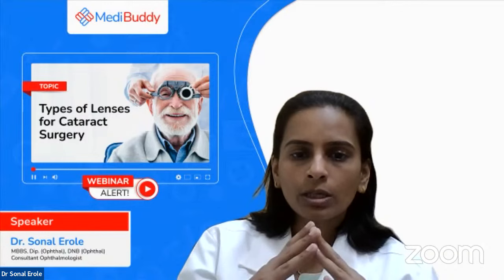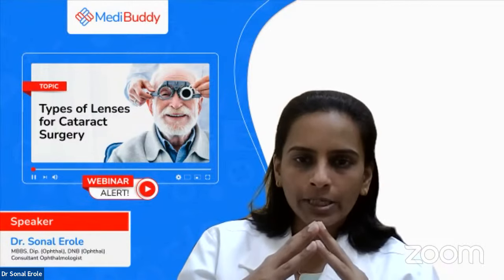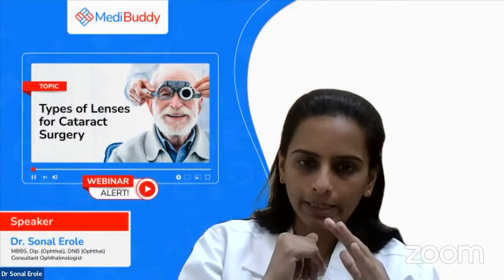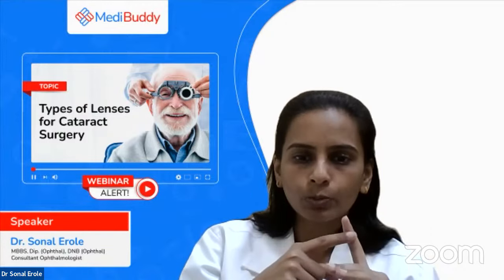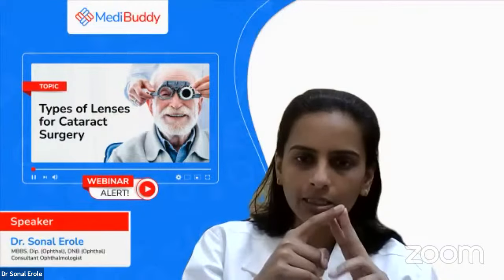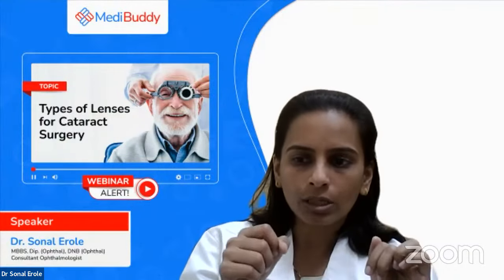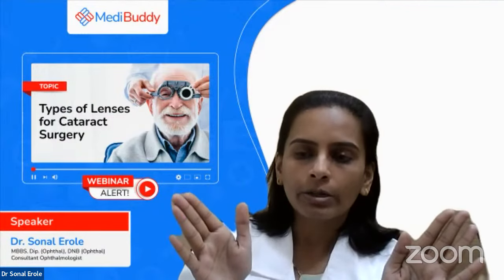In refractive surgery, basically we are operating either on the cornea or we are putting a lens inside the eye. Before doing any of these procedures, we measure the present condition of our cornea, what its thickness is, what its shape is, and depending on these measurements, we can go for different types of refractive surgeries.